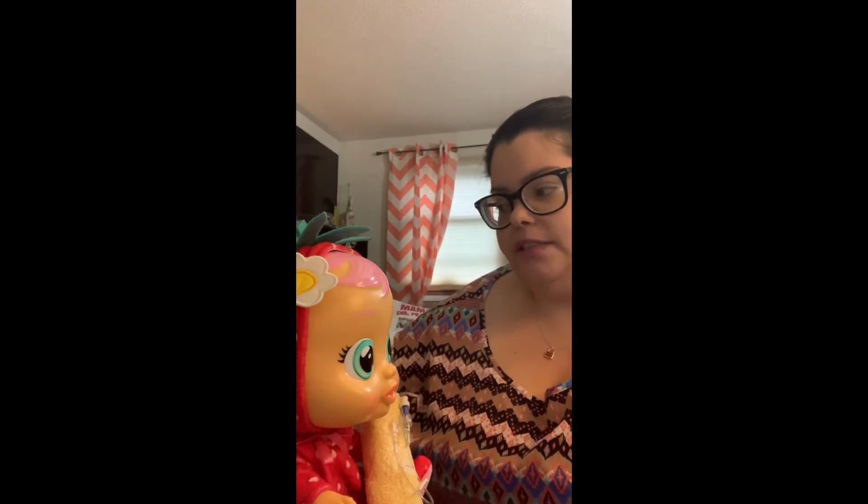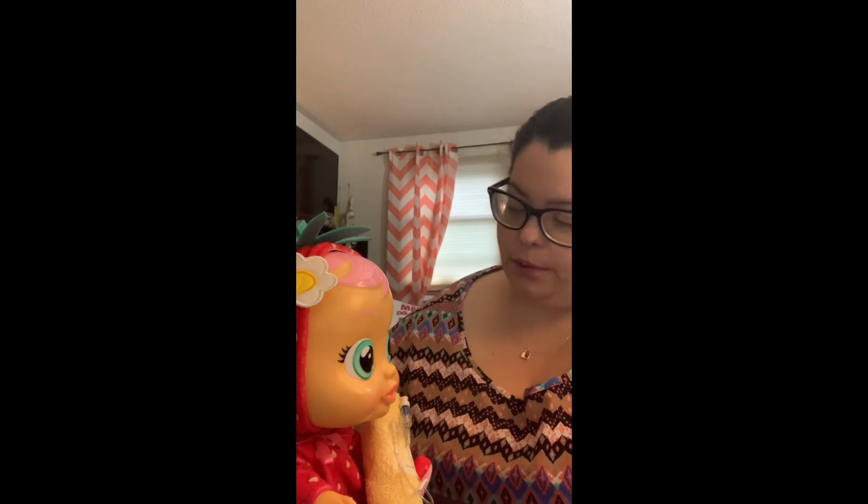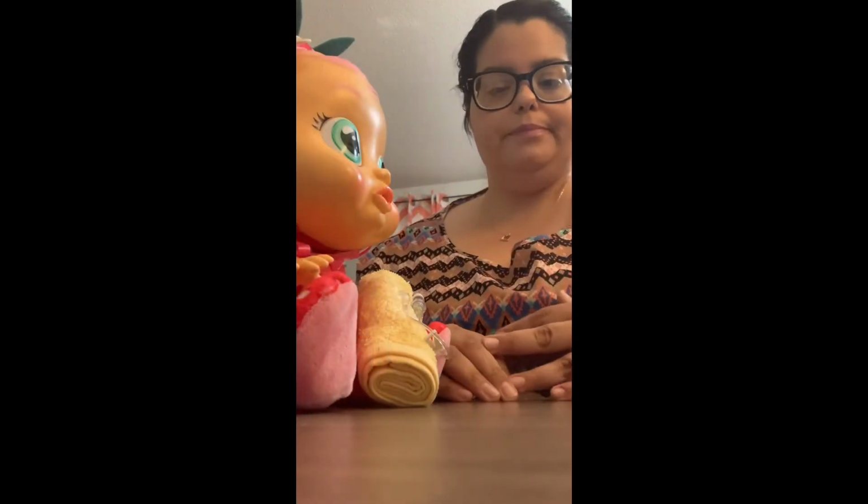So Mrs. Edwards, the doctor today has ordered some bumetanide. This will help with the fluid overload. You'll be getting 0.5 milligrams, and it is in 2 mLs. It's going to go straight through your IV, and it's going to be IV push. Do you have any questions? She stated she had no questions. So now we can initiate our procedure.